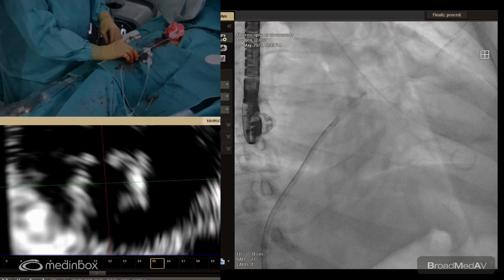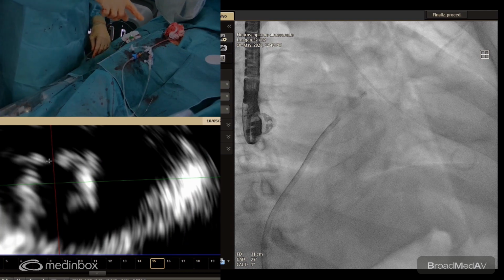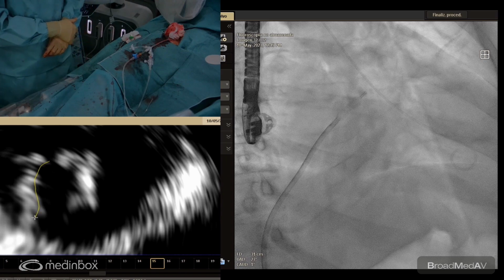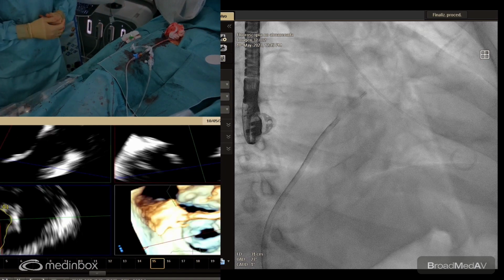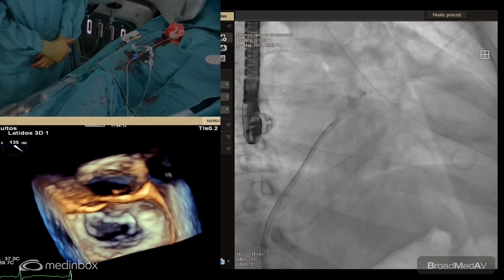It's big. Can anyone measure the gradient outside? Todavía no ha caído a la diastólica exactamente, pero bueno. 2.3. 2.3. Yeah. The gradients are a very good result.